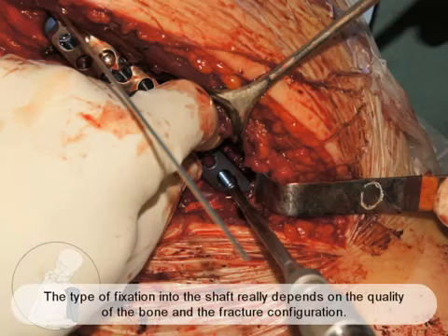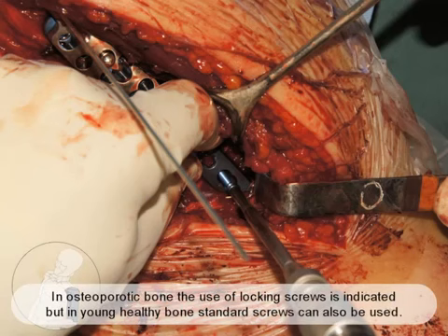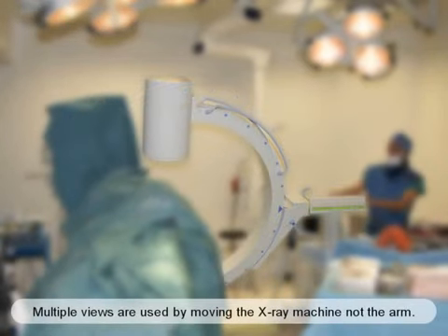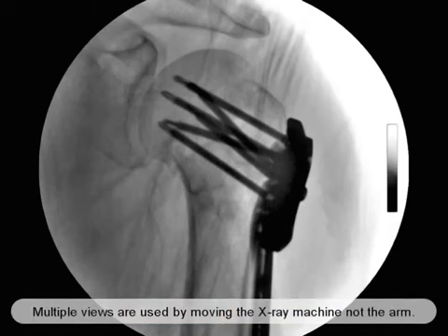The type of fixation into the shaft really depends on the quality of the bone and the fracture configuration. In osteoporotic bone, use of locking screws is indicated, but in young healthy bone, standard screws can also be used. Once fixation into the shaft has been achieved, the arm is checked radiographically to confirm position of the plate, reduction of the fracture, and the length of the screws. Multiple views are used by moving the X-ray machine, not the arm.